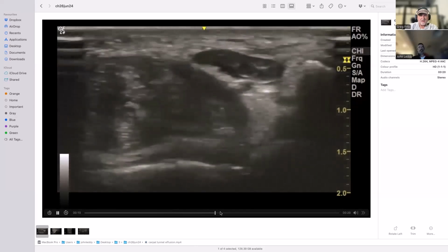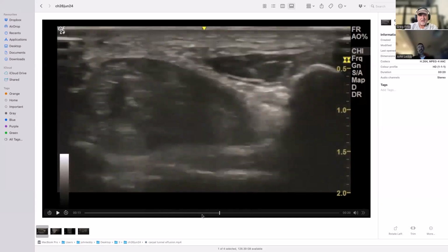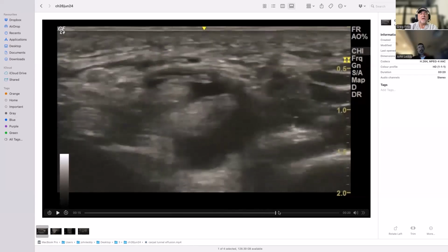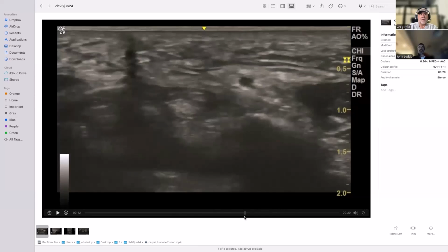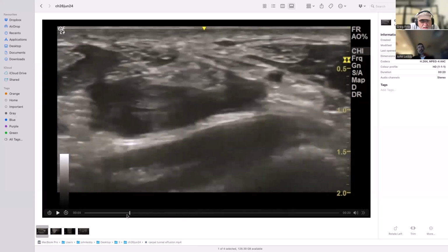It's a big old effusion. You take it back. Within the tunnel. Yeah, or certainly in the forearm, tracking down towards the tunnel. Yeah. In the tunnel, there's a bit going on there, and then there's a bit of fluid. So in the tunnel itself, there's actually no fluid at all, or very little. I see that. Just see it pushed distally and proximally.